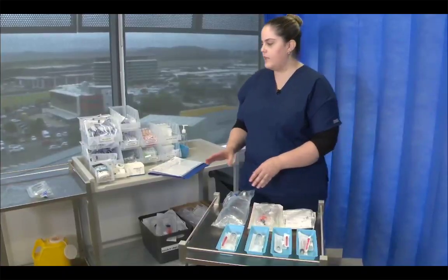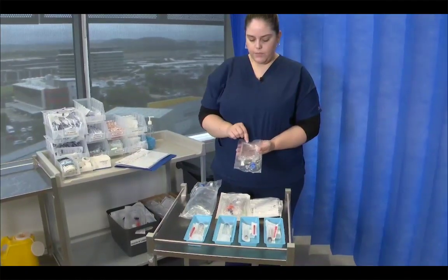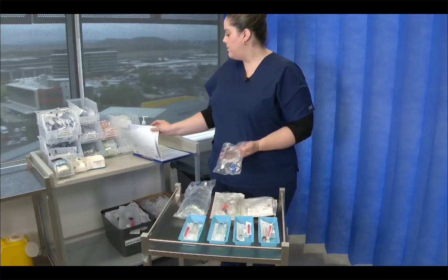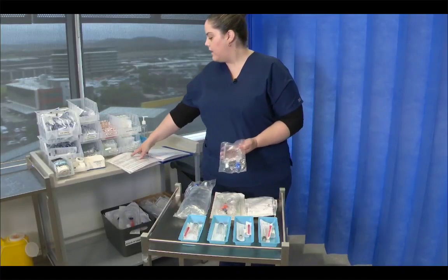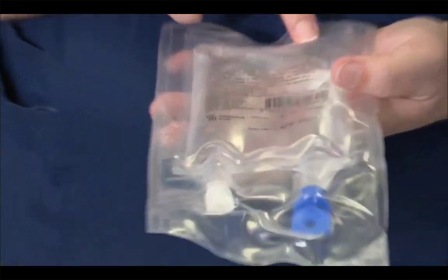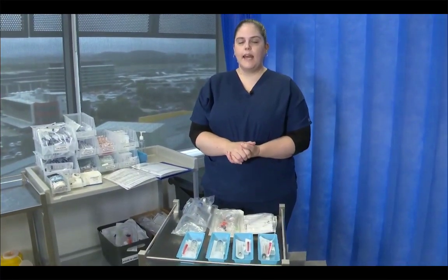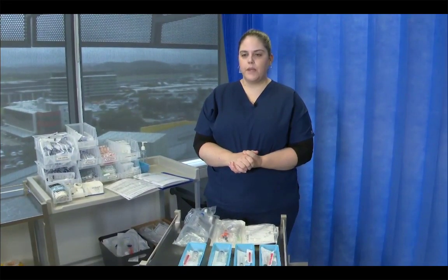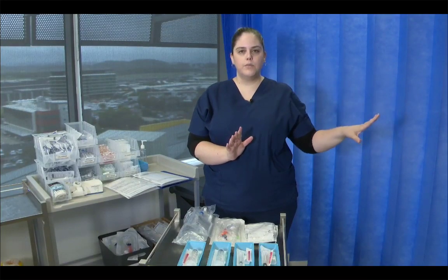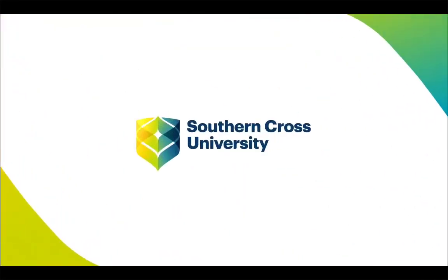My second thing that I need to grab is also an IV mini bag, 100 ml sodium chloride, because according to my PCA order, this medication is going to be using a diluent of sodium chloride, 100 ml. So I've grabbed sodium chloride, 100 ml, expires 2025. The last thing we need to gather is our S8 medication from the cupboard. So for this task, we actually need 2 RNs to proceed to the treatment room, unlock the DD cupboard and grab that fentanyl medication.